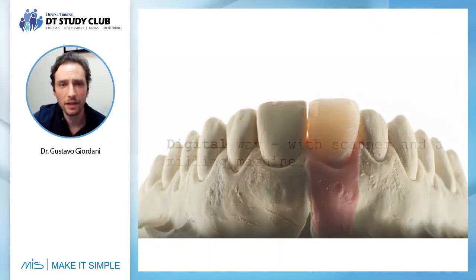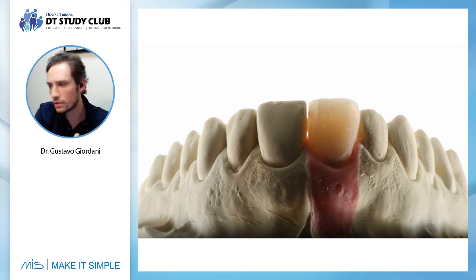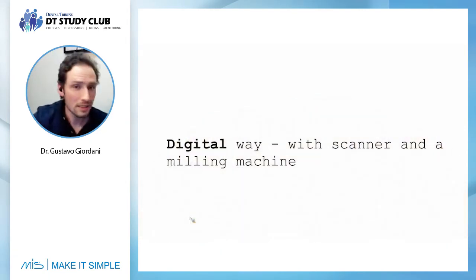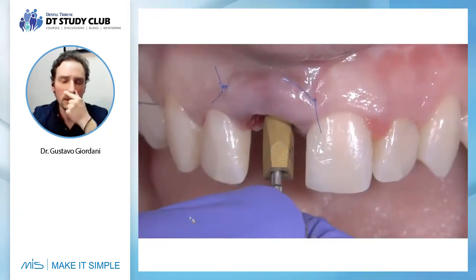So this is very nice, this is very easy, but takes a lot of time, and you need a technician by your side. So this is the analog way, which is very intelligent and works very well. Then we decided to move on to the same technique, but now go into the digital world. So that is what we did in Monica's case.